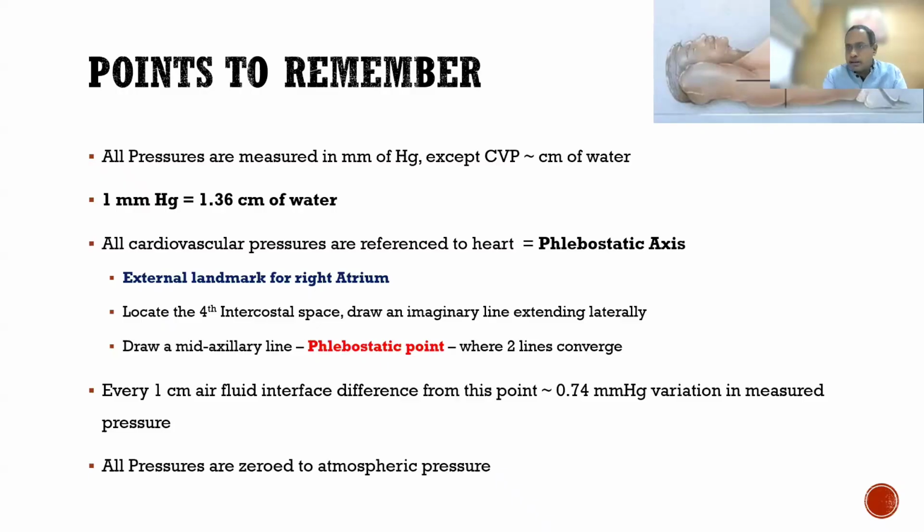For arterial pressures like radial arterial or invasive arterial blood pressure monitoring, it may not make much of a difference. But for measurements like central venous pressure, and intra-abdominal pressure, which is actually not measured from this site, but just for the reference, if you change the point by 1 centimeter or 2 centimeters, it increases the pressure by 2 centimeters. So the interpretation of the pressure may be false. So it is important to measure this point and keep a large scale in all the ICUs wherever you are working, so that we exactly zero the transducer at this point.